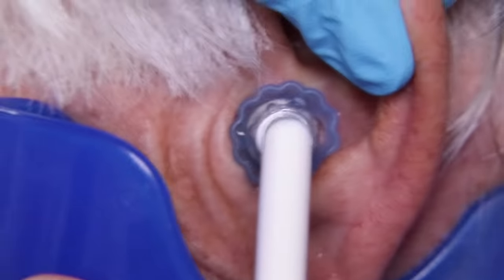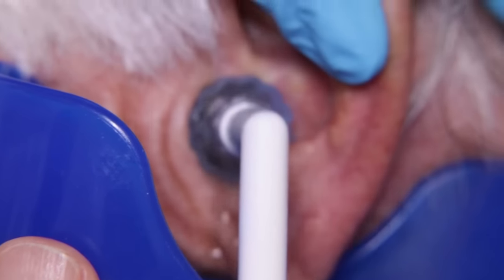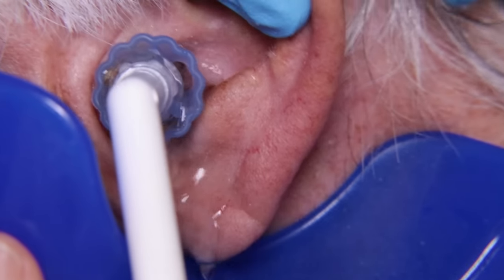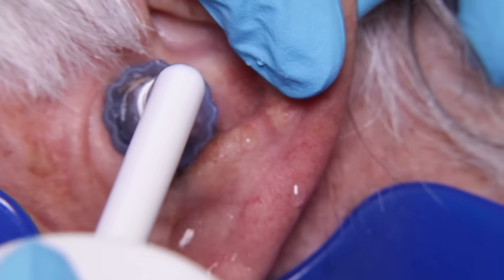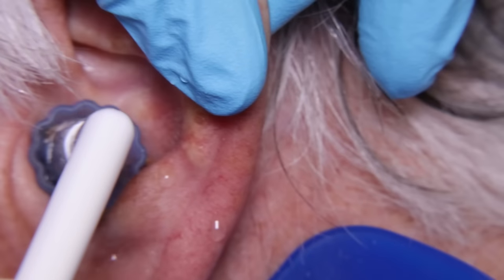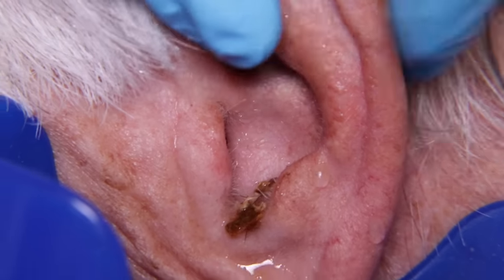Here we go — we're getting stuff now! Can you see it? There we go. Finally. We can see that ear, we can see that eardrum on the left after all of that.